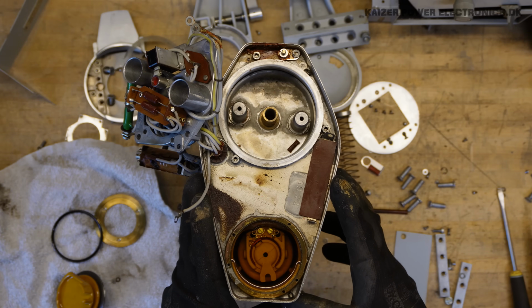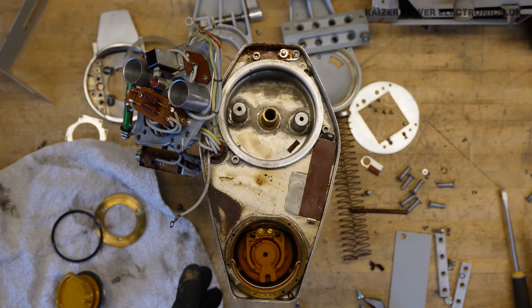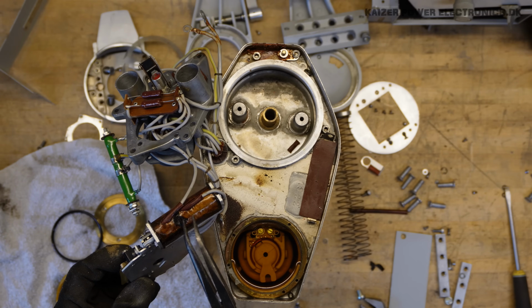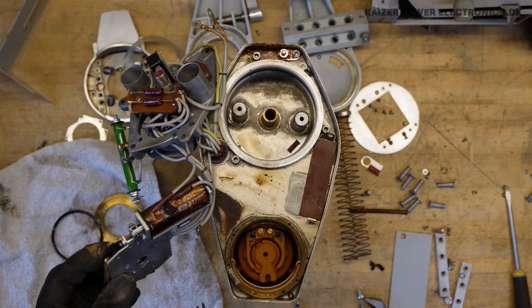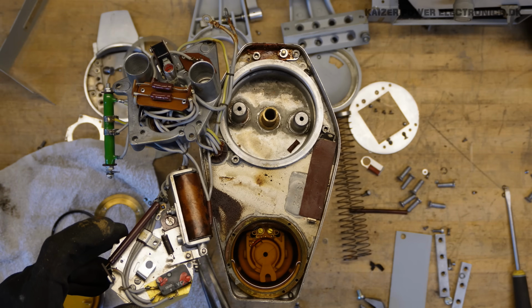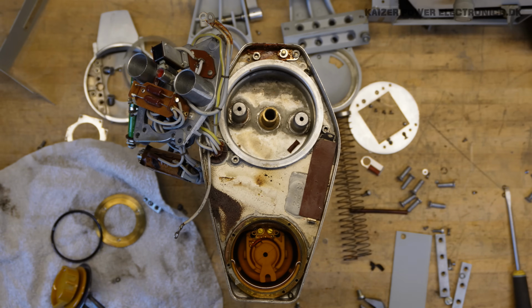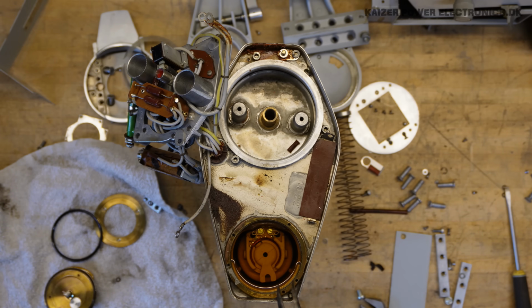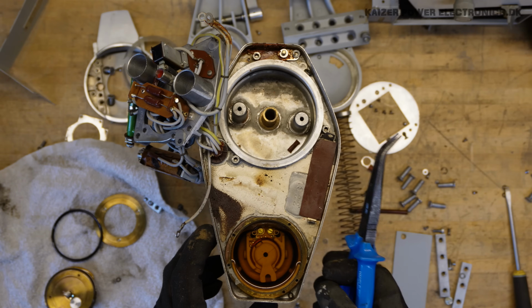We are now staring down into the oil. You can see it down here. And the whole relay thing here, which is actually burned on the backside. Okay. There's probably a reason this was thrown out at some point. But the whole relay here is actually the focal point selector. By rotating this mechanism, you can see down here that it has the small arm that can rotate the anode of the X-ray tube.